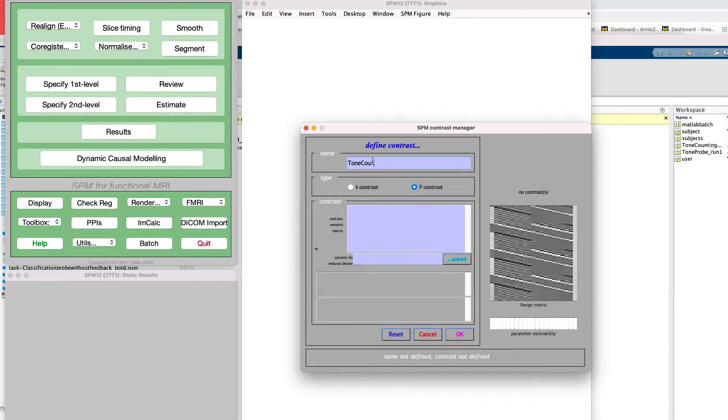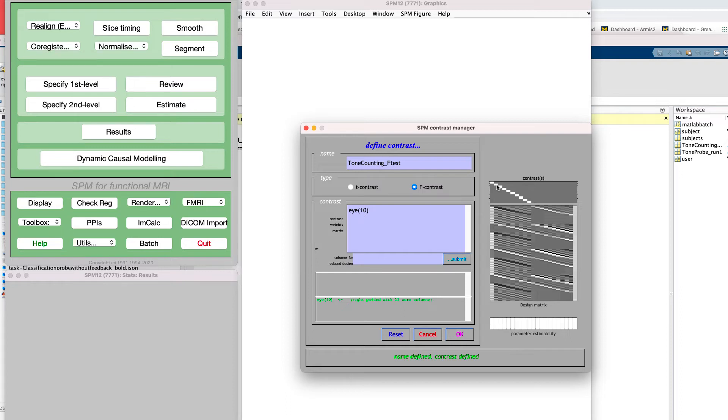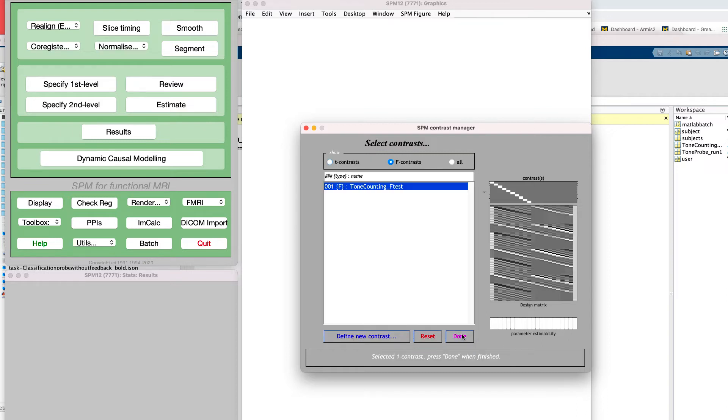Click on the F-contrast radio button and click on Define New Contrast. Give it the name Tone Counting underscore F-test. And in the contrast field, type I, parentheses, 10. This will create a diagonal of ones with one per time point for the tone counting condition. Click OK and then Done.